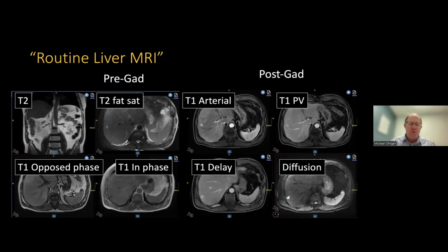And MRCP versus MRI is really for looking for masses or other things that you can't see on CT. Now, the advantage of CT is that the spatial resolution is much higher. So for things like pancreas cancer staging, CT is always better because you can see the blood vessels a lot better. Hope that's great.